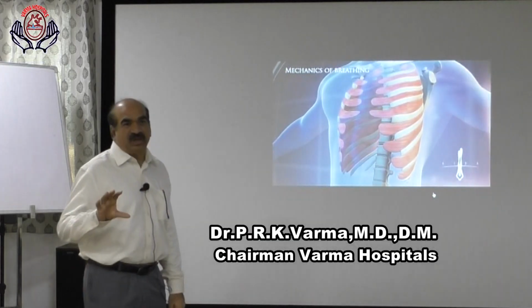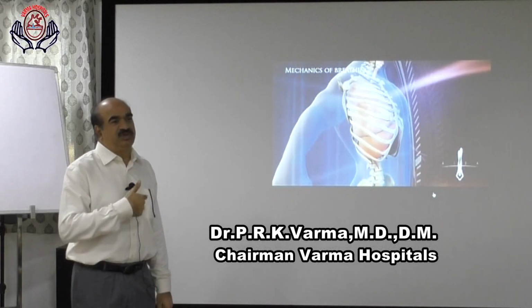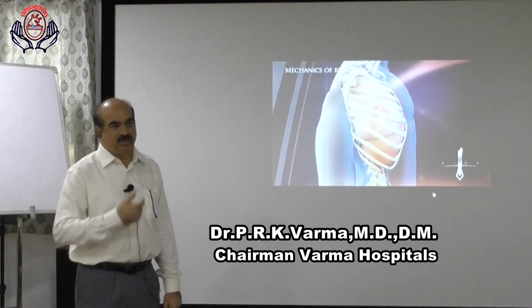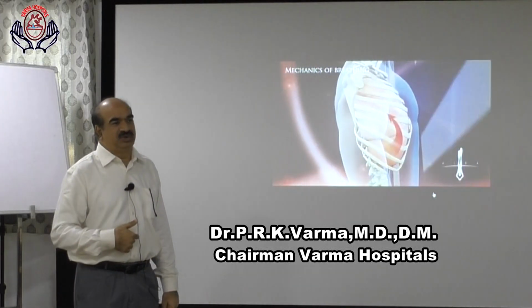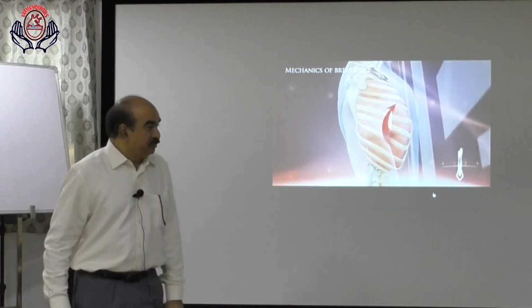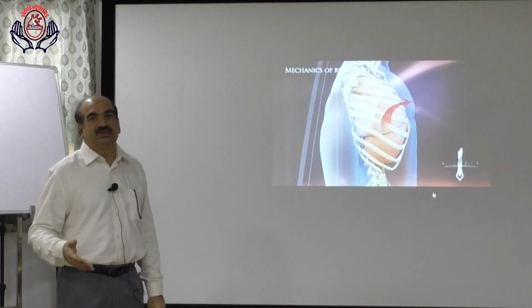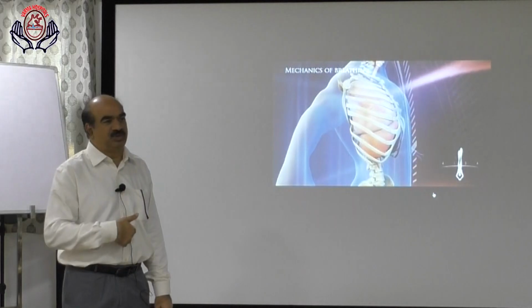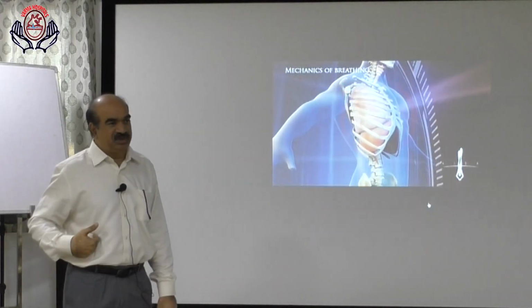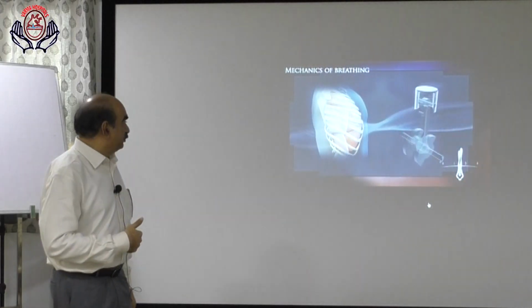So we should observe diaphragm activity, but diaphragm activity can be assessed by esophageal electrodes. If we keep an esophageal probe with electrodes, we can assess the diaphragm activity, having transpulmonary pressure also. In advanced ventilator settings, in severe cases of ARDS, we can put an esophageal electrode and assess diaphragm activity, neurally mediated diaphragm activity and transpulmonary pressure.